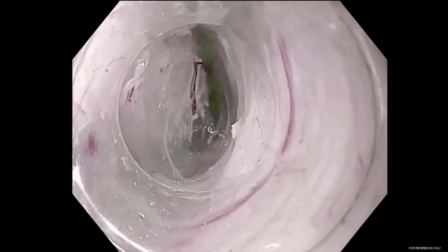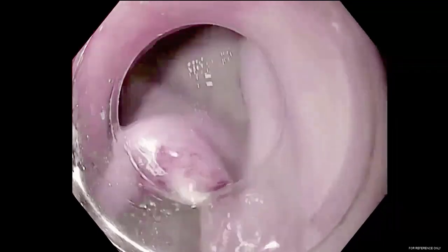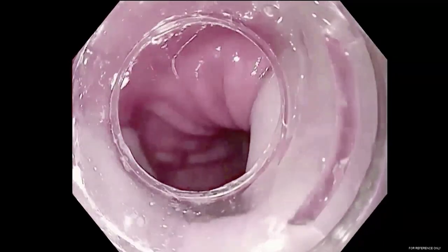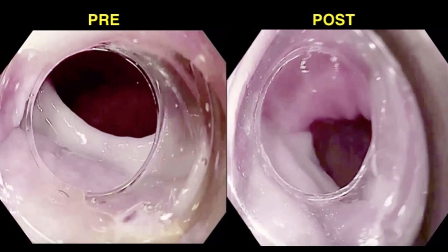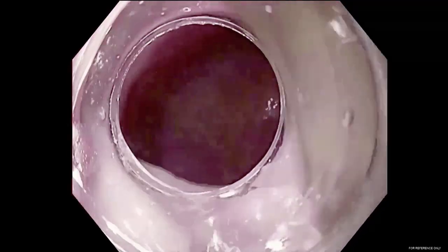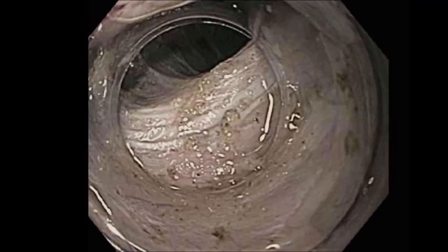During the submucosal tunneling, it is easy to identify some dense fibrosis, as seen in the video. During the tunneling procedure, we came back to the lumen to make sure we were in the right direction. After tunneling through the fibrotic submucosal tissue, improvement of the stenotic area can be observed. After checking the direction, we returned to the submucosal tunnel to identify the fibers and the stenotic area.